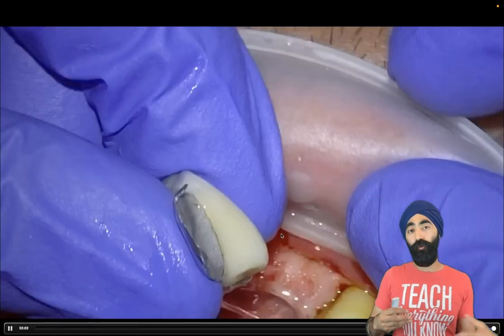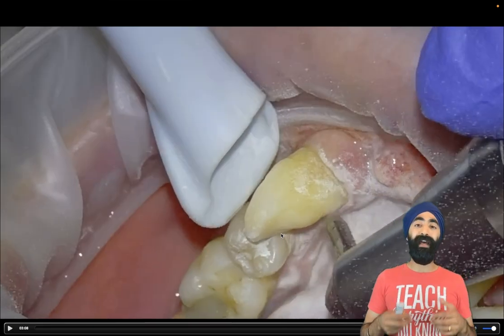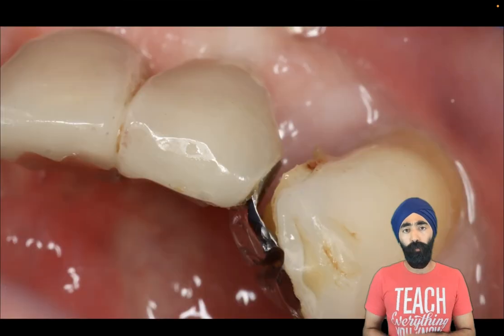I'm going to go through my bonding protocol that involves getting the abutment retainer super clean. I'm going to air abrade the tooth itself to get rid of any biofilm and staining to optimize the surface for bonding.